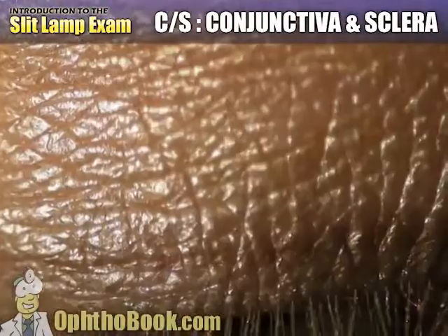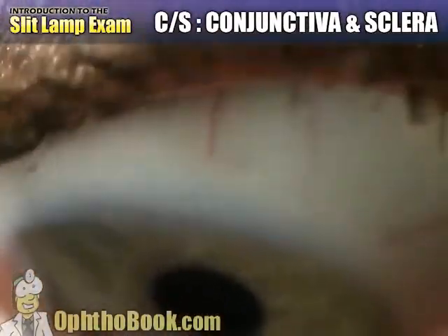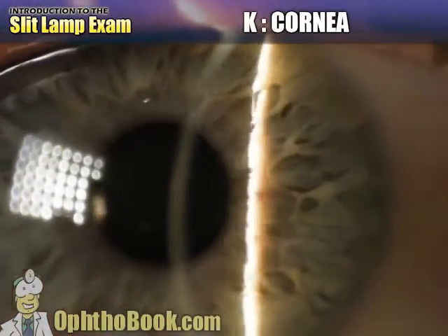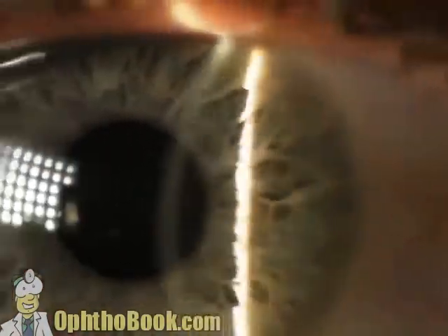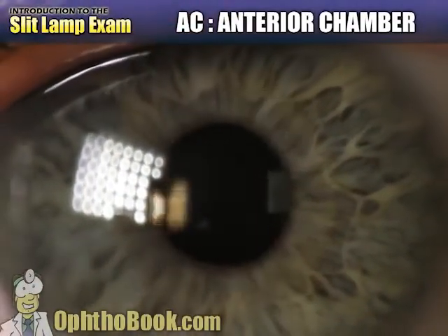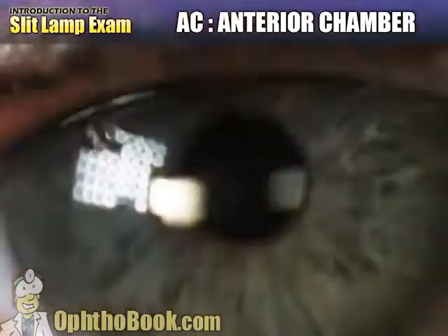The conjunctiva and sclera, the surface conjunctival vessels, and the sclera, I have my patient look up, down, left, and right, so we don't miss anything. And then we look, of course, at the cornea. I make a very thin slit of light, go across, looks clear here, no problems. The anterior chamber, I make my beam shorter, a little bit wider, use the pupil as a black background, it looks deep and quiet. Then we move on to the iris.